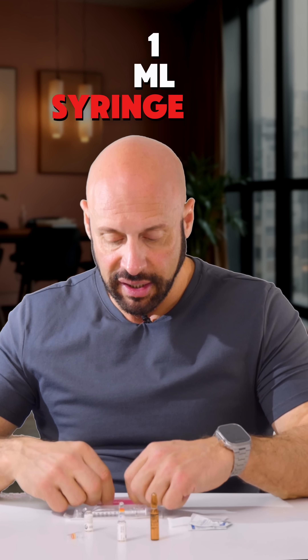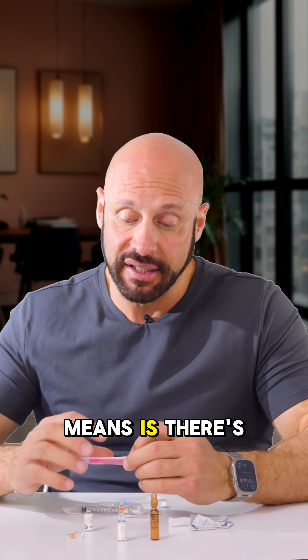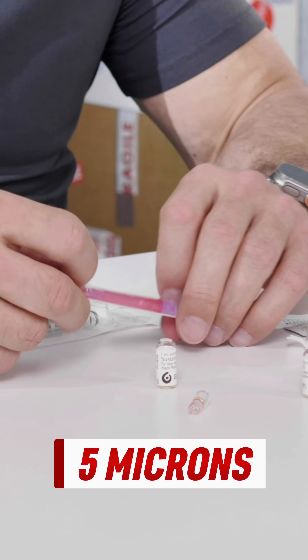This is a 1ml syringe. This is an 18-gauge, 1-inch inline filter needle. What that means is there's a filter within this needle that helps filter out any glass particles — it's going to filter out about 5 microns.